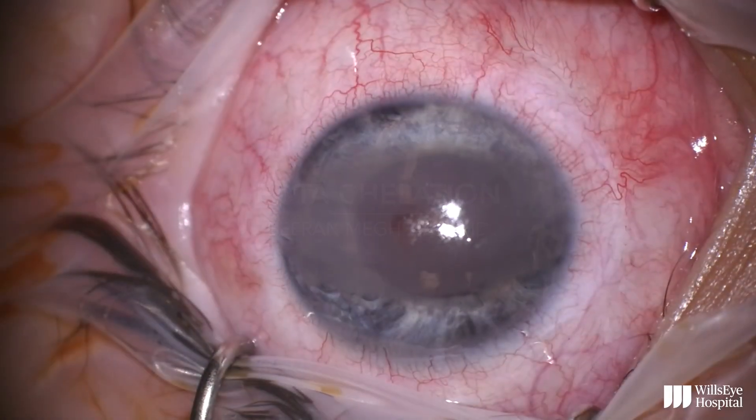This is Dr. Vera McPara from Wills Eye Hospital, and this is a video showing the steps of EDTA chelation for band keratopathy.